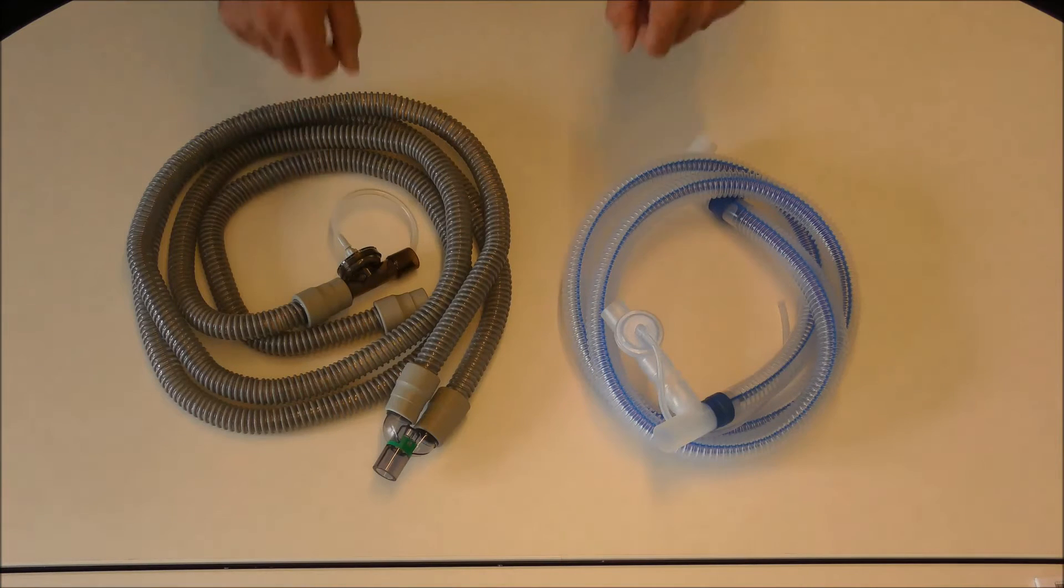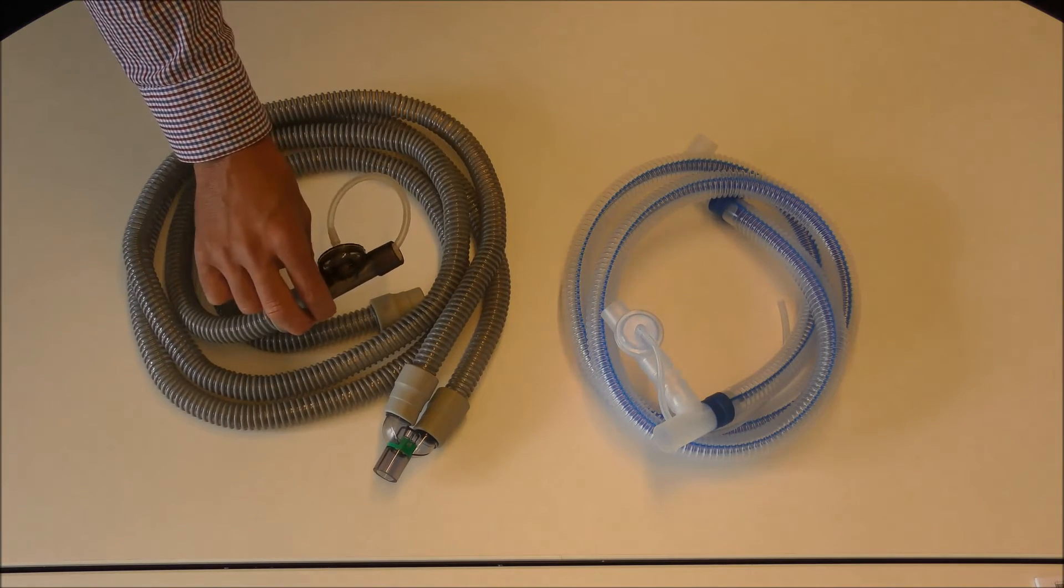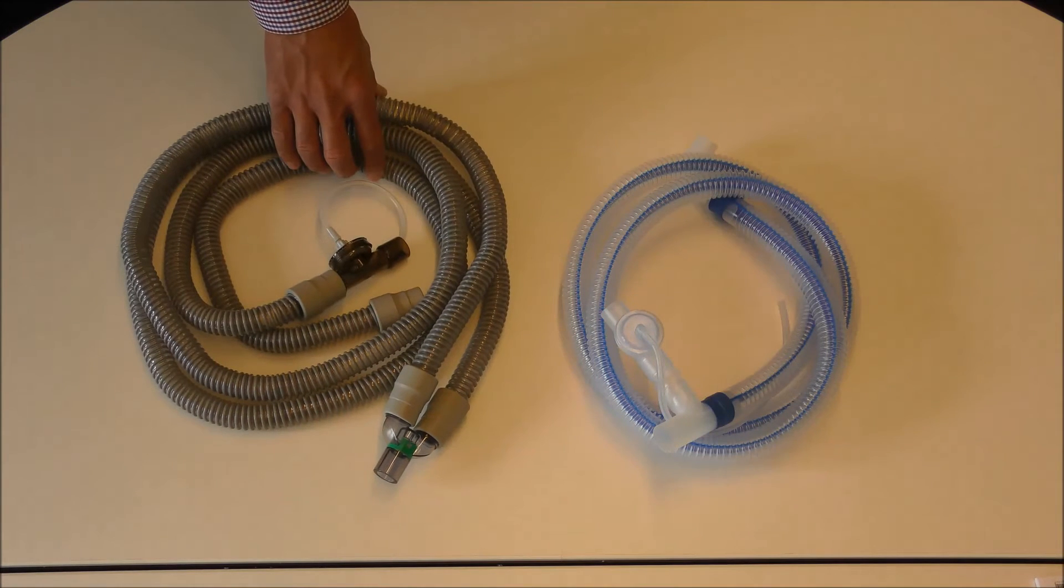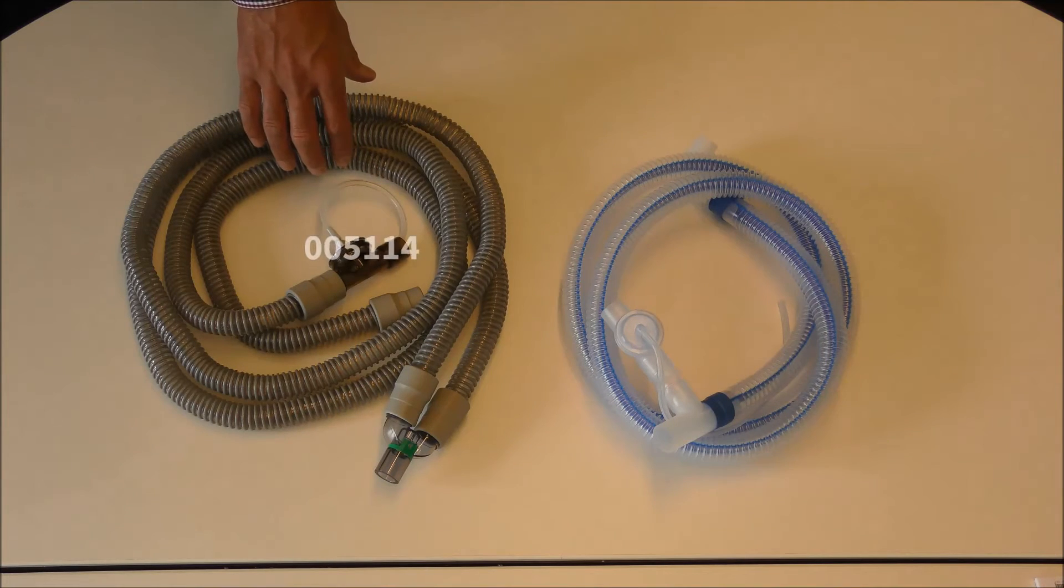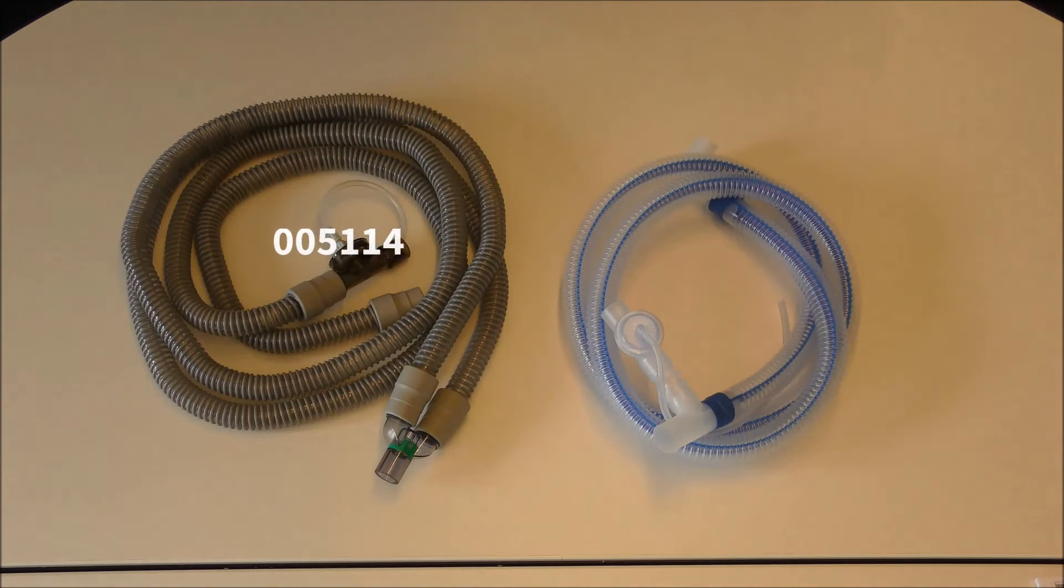Here we see the dual limb circuits to be used with the Vivo50 ventilators. The active exhalation valve can be placed near the ventilator. This is the reusable circuit with part number 005114 and this is the disposable circuit with part number 005118.